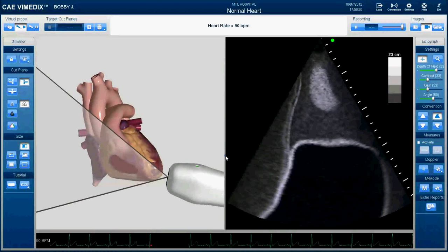This has gotten pretty sophisticated, but the principle is still the same — things that reflect sound show up as white, and things that don't reflect sound don't really show up. Things that don't reflect sound are air, empty spaces, blood, and a number of fluids. You'll see here that on this plane of cut, nothing much is being reflected back — it's all gray. On this plane you can see we're just starting to go through the edge of the myocardium, which is reflected here. White means it's hitting substance and reflecting sound back.